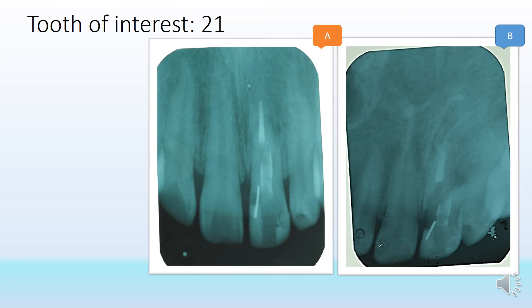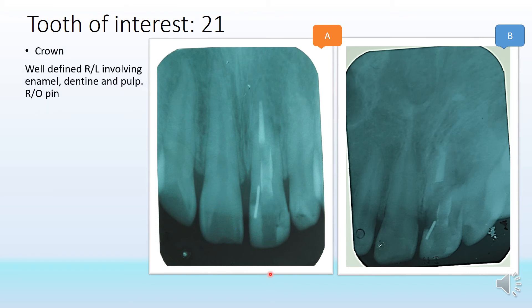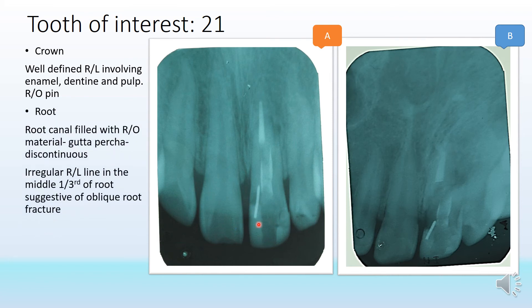The shadow of the nose is visible in image A but not clearly in image B. The tooth of interest is evidently 2-1. The crown shows a well-defined radiolucency involving the enamel, dentine, and pulp. There is also a radiolucent-radiopaque pin visible, generally placed for retentive purposes, along with radio-opacity indicating restorative material on the crown.